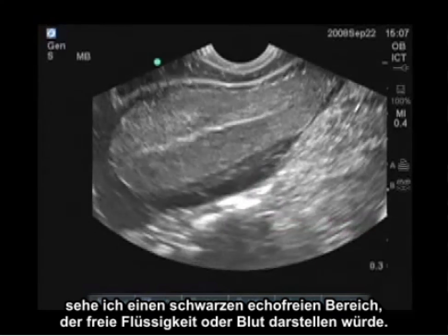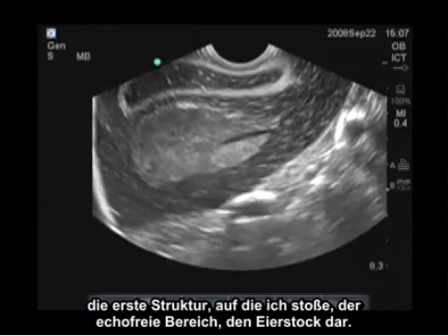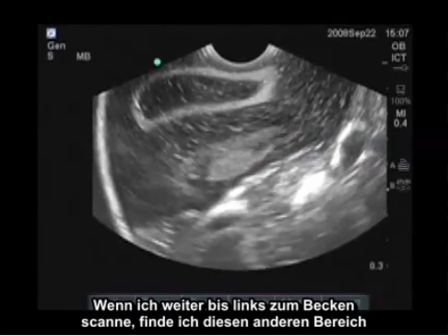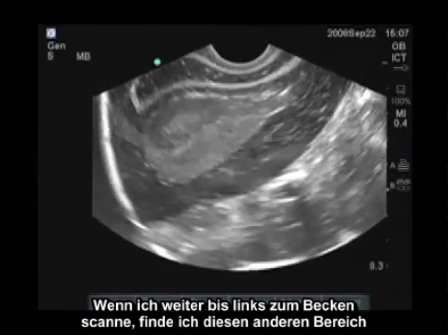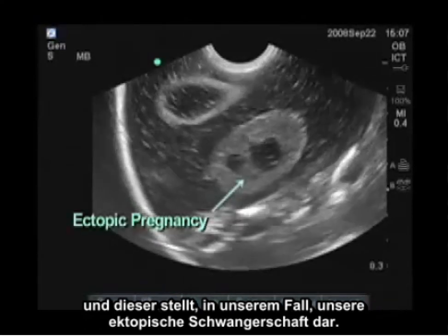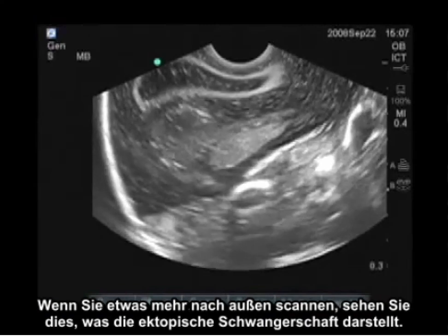If I scan all the way over to the left adnexa, the first structure I come across — this echogenic area — represents the ovary. If I keep scanning to the left in the pelvis, I encounter another area which represents our ectopic pregnancy. When I'm medial, just right beside the uterus, I see the ovary, and scanning out a little bit more, this represents the ectopic pregnancy.